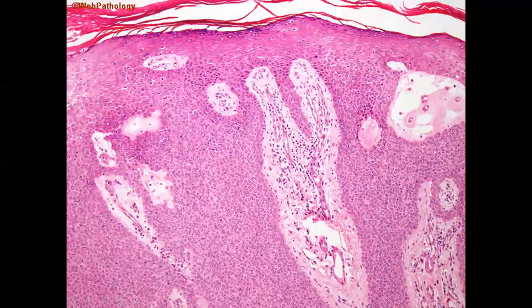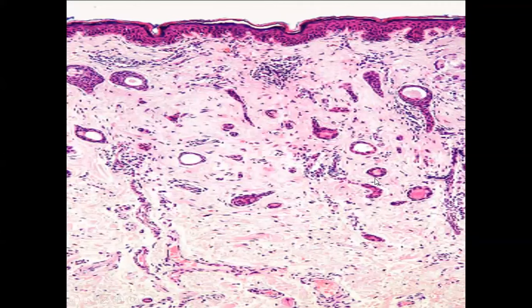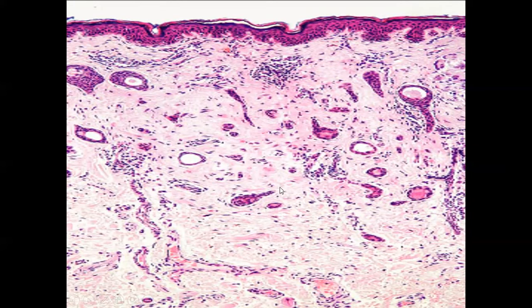Cells resembling squamous cells but smaller and cuboidal are called mini squames — these are poroma cells derived from the acrine sweat gland, present from the epidermis going down into the dermis. Another very typical appearance is ducts with thin epithelial lining, many forming a tadpole appearance — this is a feature of syringoma.